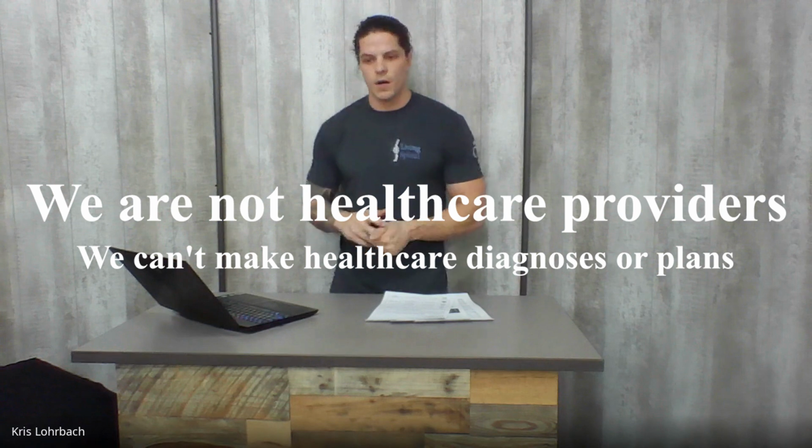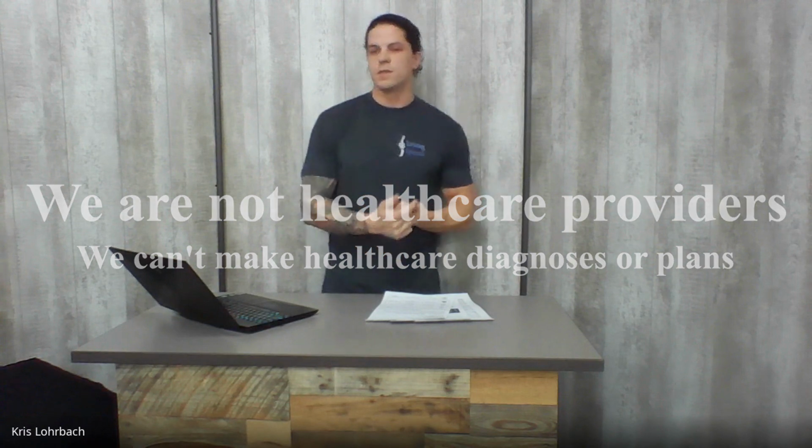I want to remind you guys that just remember not to try and create the impression with customers that we're a healthcare provider. We're a supplier of these cushions, and we can't make them recommendations within the realm of medicine. Best questions you can ask people are questions like, has your occupational therapist or your physical therapist made any recommendations to you? That's a good one to ask right away, because sometimes people won't even bring it up. And after a long time of talking to them, they'll say, oh, but my PT recommended this one. It's like, well, that's the one they should go with.